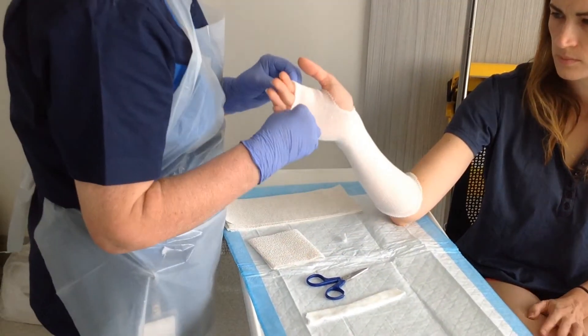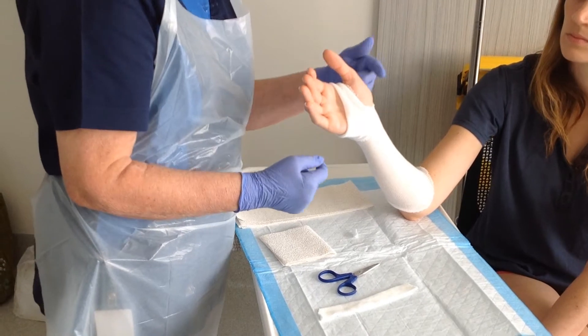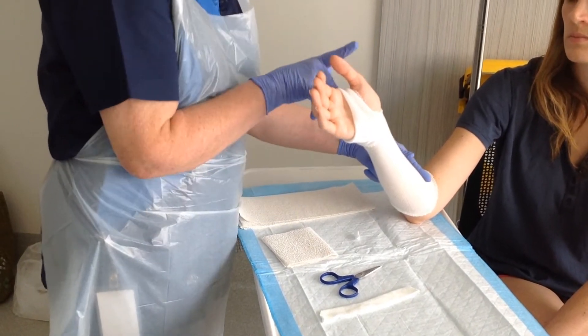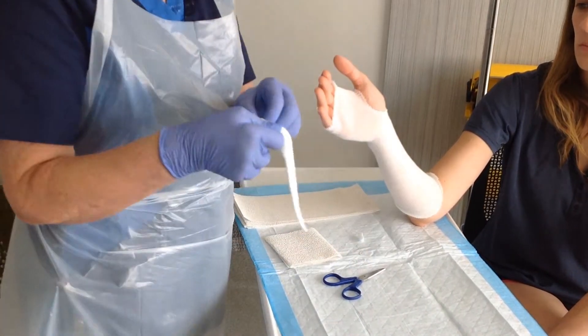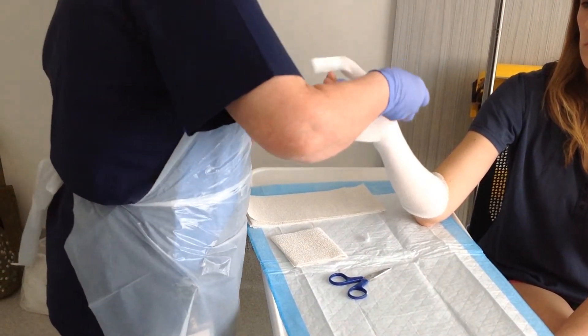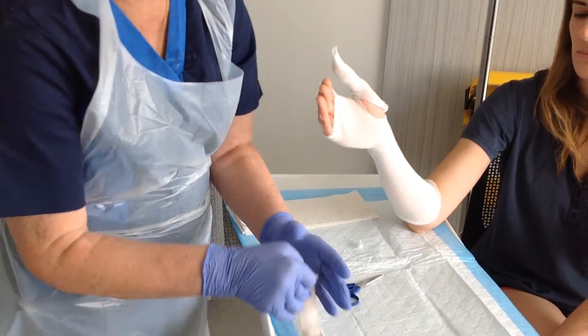At this end, at the palmar crease, we will fold down to the palmar crease — so that's the edge. The splint will stop here and finish about here. Next we apply the little sock which will cover the thumb, and with a little bit of tape we just secure that in position.